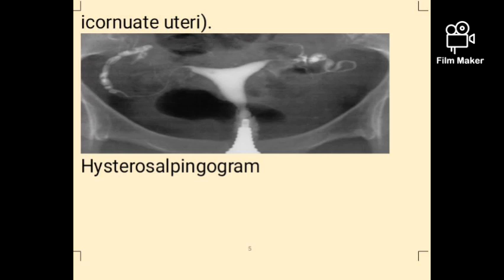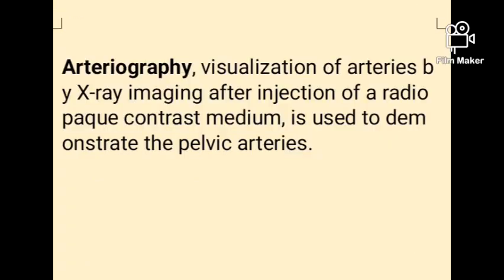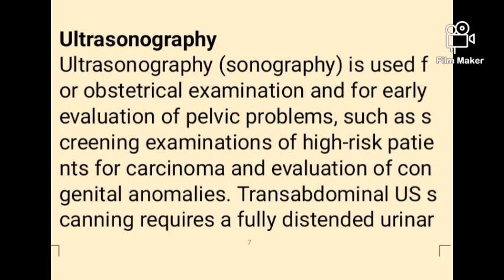As far as radiography of the pelvic region is concerned, arteriography must be mentioned. Arteriography involves visualization of the pelvic arteries by X-ray imaging after injection of a radiopaque contrast medium, and arteriography is used to demonstrate the pelvic arteries.